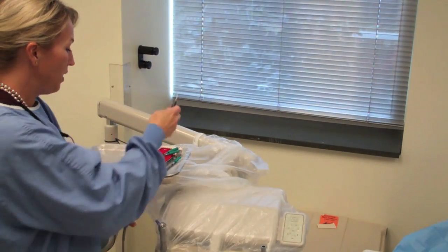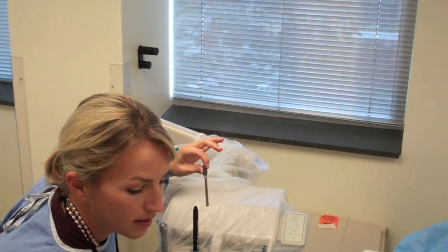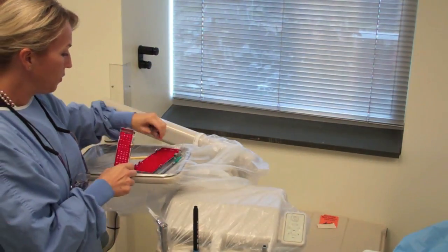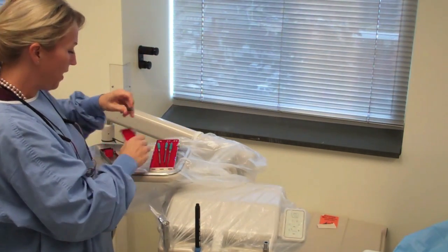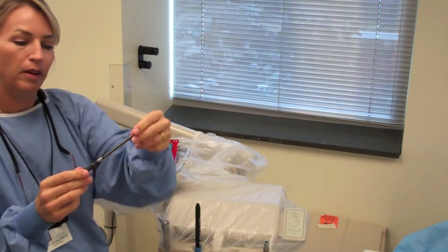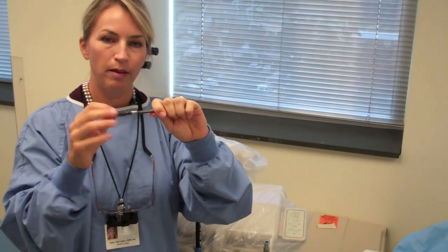The other thing to think about is inspecting the stack of your ultrasonic insert. We like these types of cassettes because you can put your ultrasonic insert in the cassette. This one, for example, is a larger cassette, so it can hold all three of the Slimline together. If you just want a single standard insert like this, you can keep it in there. It helps prevent the stack from being bent. Once the stack section gets bent, because of putting it in the ultrasonic, or because it's wrapped in the pouch and several instruments get stacked on top of it, this insert becomes less effective and less effective over time.